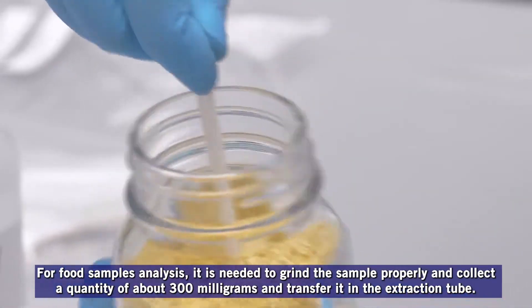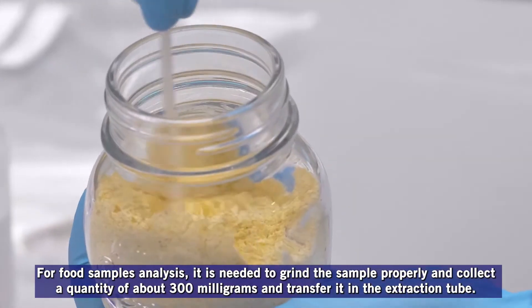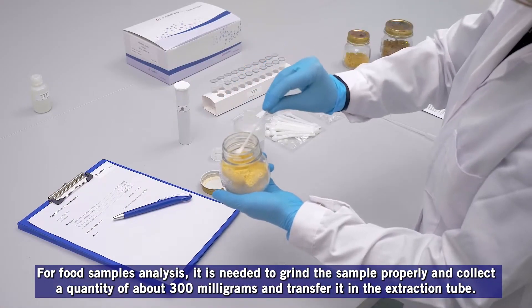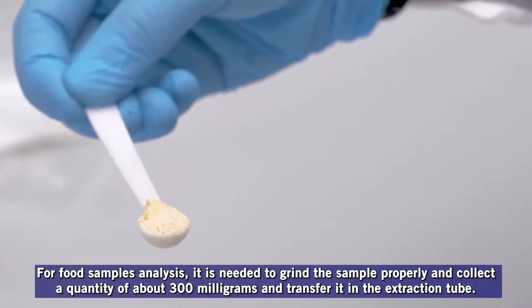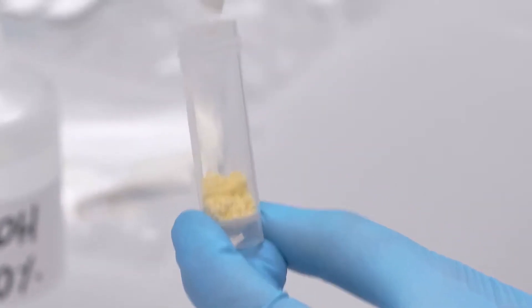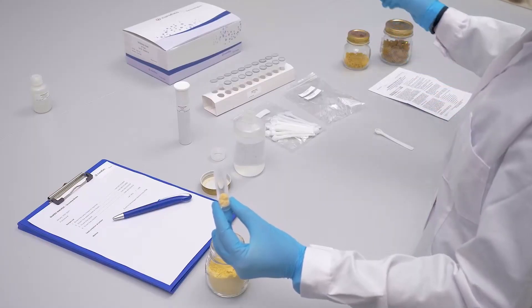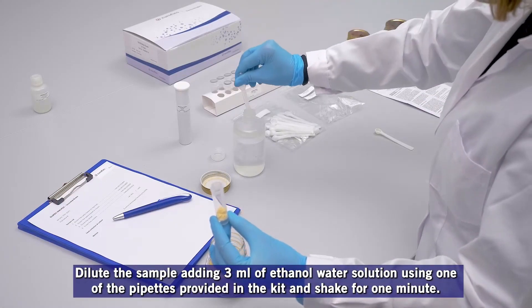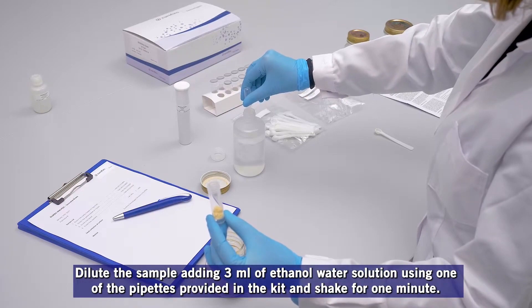For food sample analysis, it is needed to grind the sample properly and collect a quantity of about 300 milligrams and transfer it into the extraction tube. Dilute the sample by adding 3 milliliters of ethanol water solution, using one of the pipettes provided in the kit.